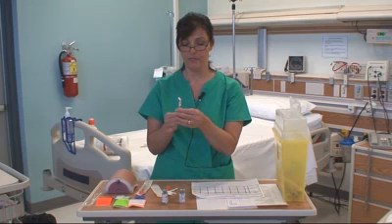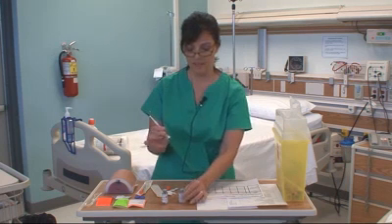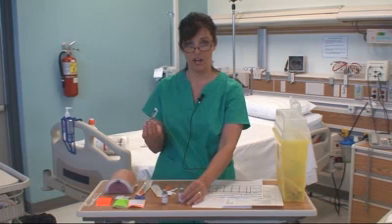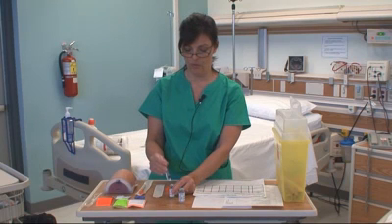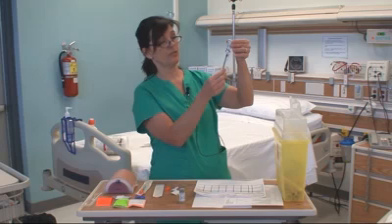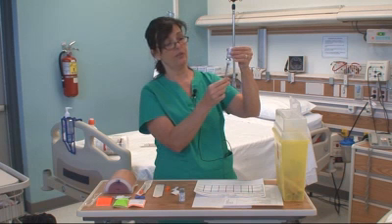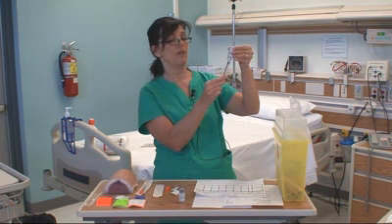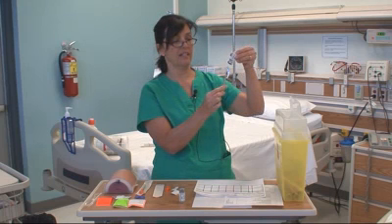So I'm removing that. The first thing I'm going to do is pull back on the plunger to 40 units, and I'm going to inject 40 units of air into my long-acting insulin. Then I'm going to pull back 4 units of air and inject 4 units into my short-acting insulin. Without removing the needle, I'm going to make sure that the tip of the needle, the bevel, is underneath the liquid. This is a full bottle, but certainly you may have to pull your needle out to make sure that it is always underneath the level of the liquid. Now I'm going to withdraw 4 units of Humulin R, which is your short-acting insulin, the clear.